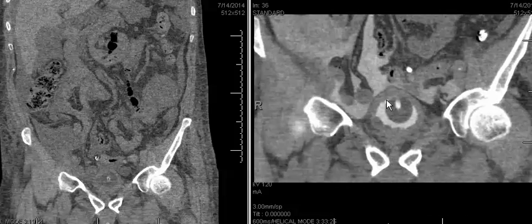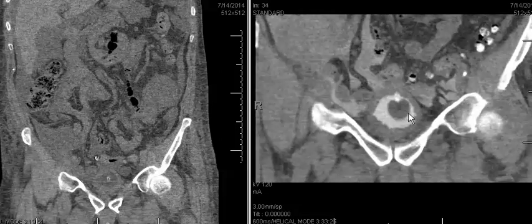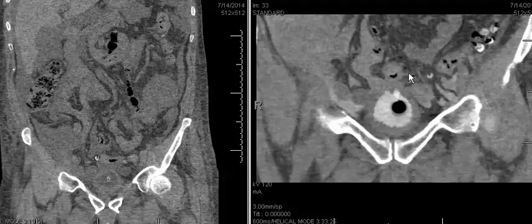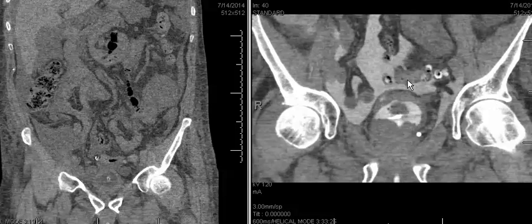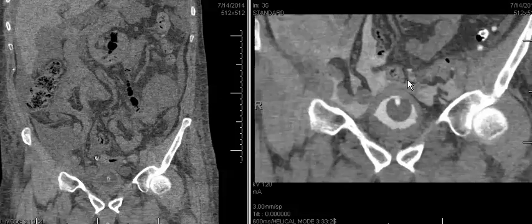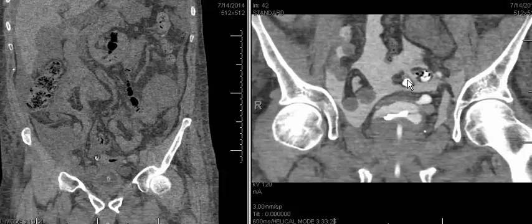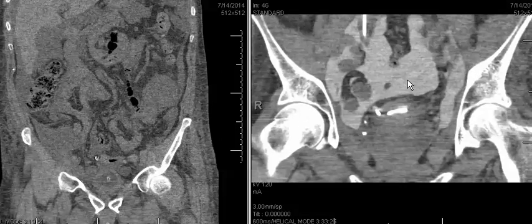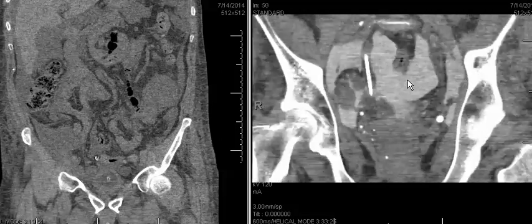These findings are all compatible with an intraperitoneal bladder rupture. It's important to make this diagnosis as this is a surgical indication for repair of the bladder, as opposed to an extraperitoneal bladder rupture, which is treated conservatively and is associated more often with pelvic fractures, which we did not see in this case.